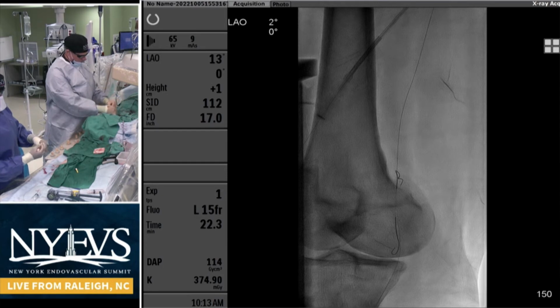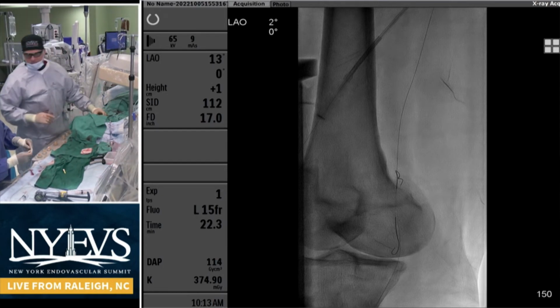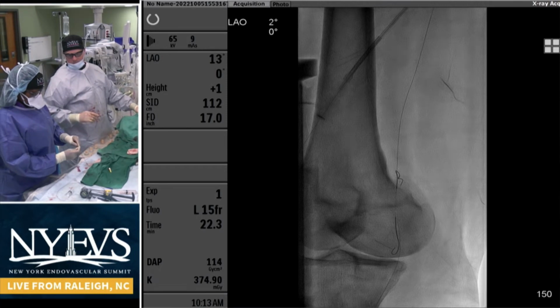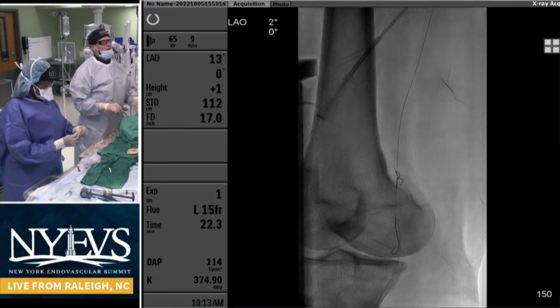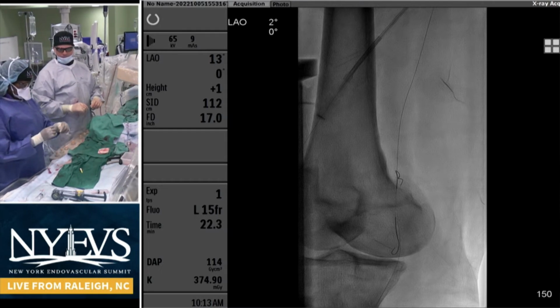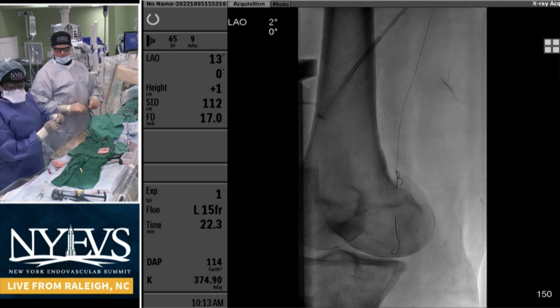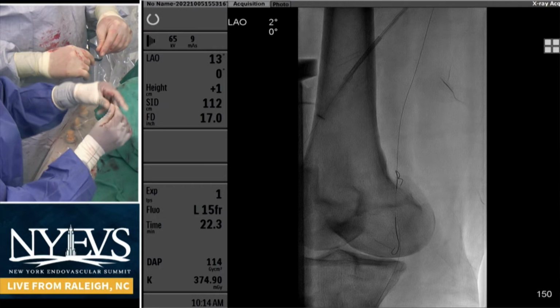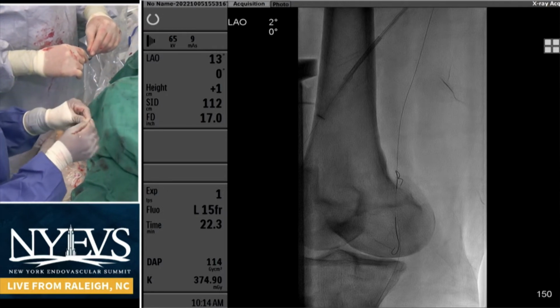All right. Dr. Ansari, how about you? You would take a wire, catheter, glide, loop technique? No? Nobody likes it? So I have tried it. It's like a last resort thing. I would still change wires of different consistencies, go up to 018 and try harder with the catheter. I have gone up to 035 as well, sometimes even as a last resort using the back of some wires. I won't recommend that, but it's more like a last resort technique.